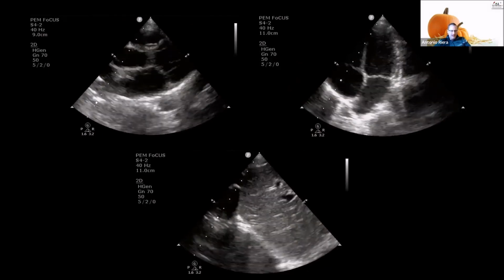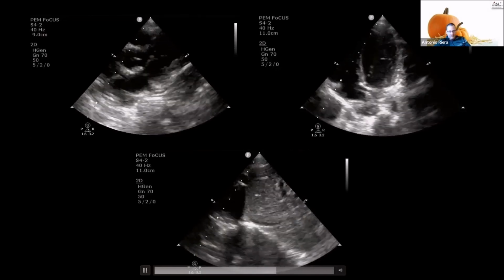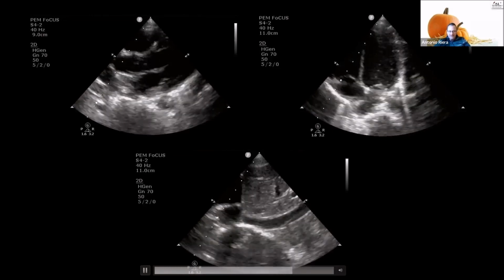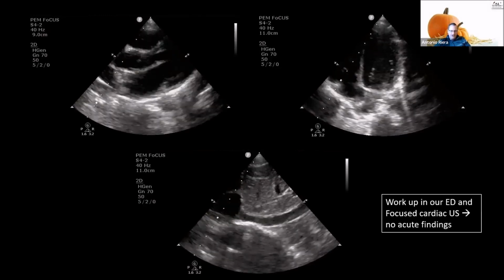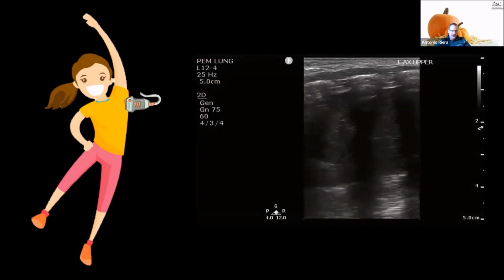And it was curious, during sign out in the morning, they mentioned that she had gotten an x-ray, and the x-ray report was officially read as negative, but there was some comment in passing that maybe there was something on the left side. But if you look at the medical record in the chart, the x-ray was read as negative. And so I had something to at least try to scan the left side of her lungs.